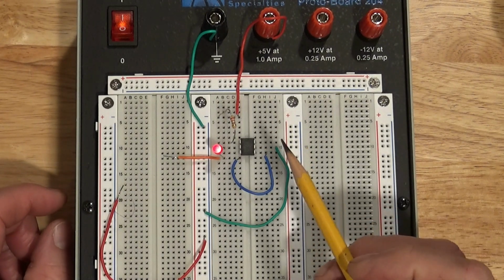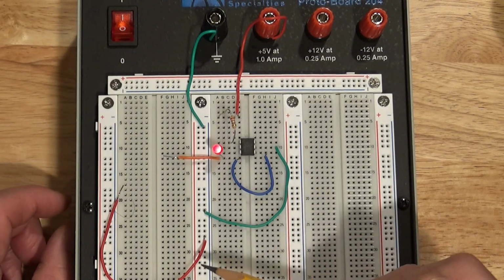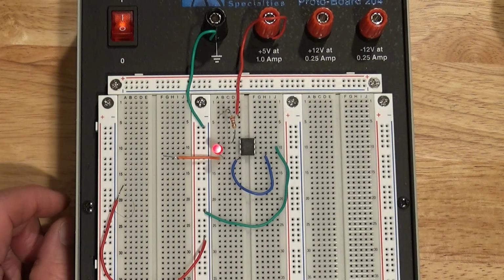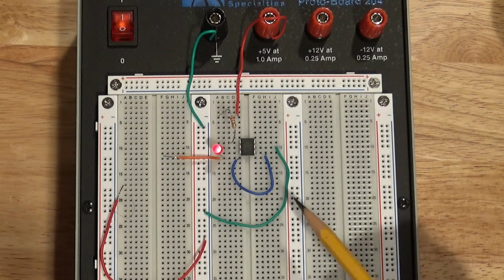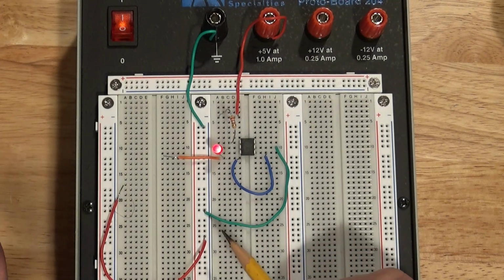And this way, if you don't get a channel indication on a wire, then you know there's an opening. Maybe the silver paint's not conducted, or there's a poor solder joint somewhere. Most of the time that's not a problem, but it's good to check it. This is mostly to determine the location of the channel on the array.